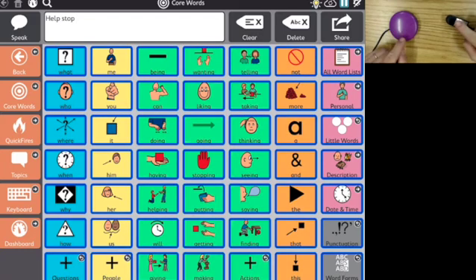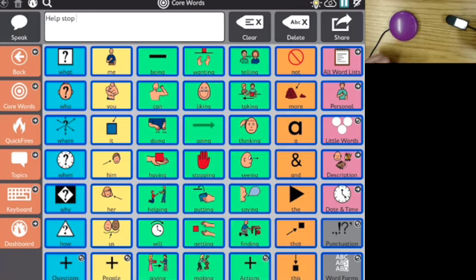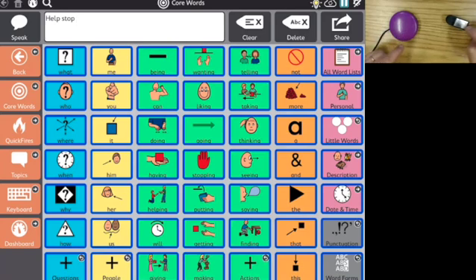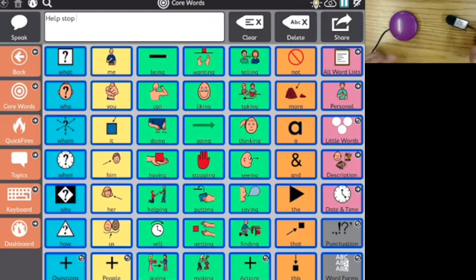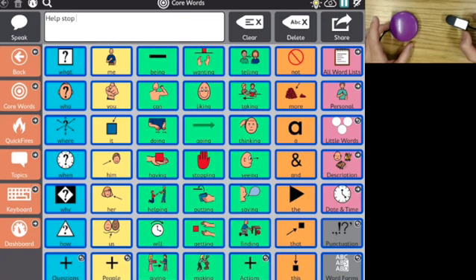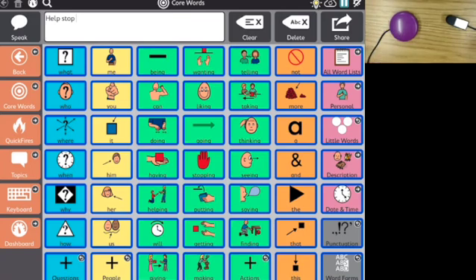If I can use two switches, I have a lot more control over what's happening on my switch screen. You can see this required being able to hit the switches repeatedly and quickly for me to be able to move through all of my options. That's an example of how you can use switches to control a communication app.